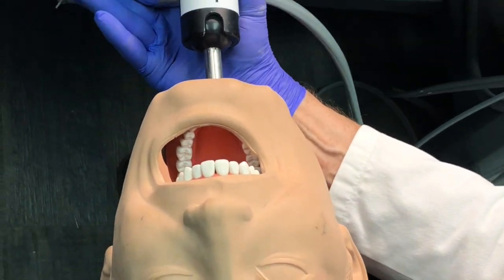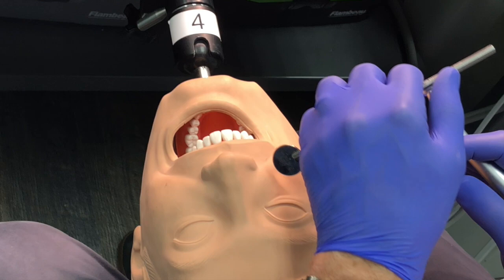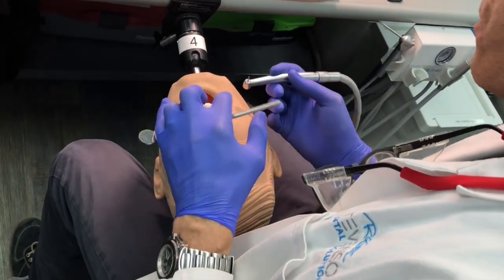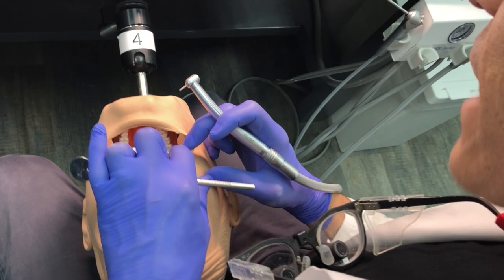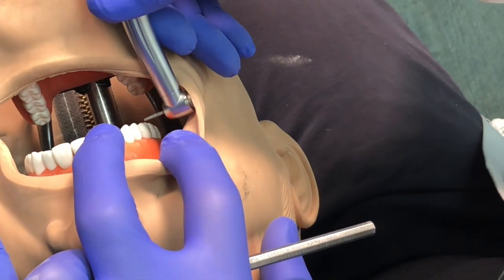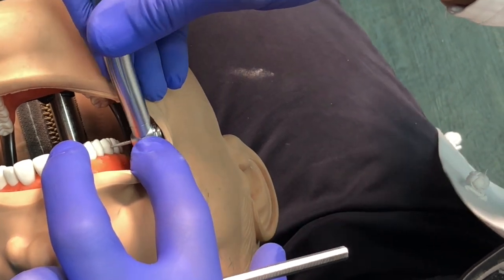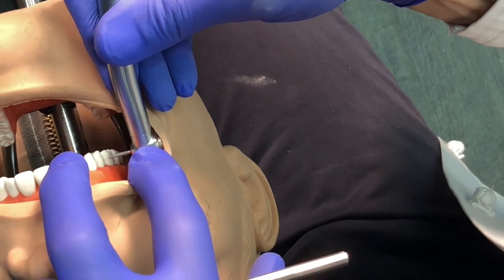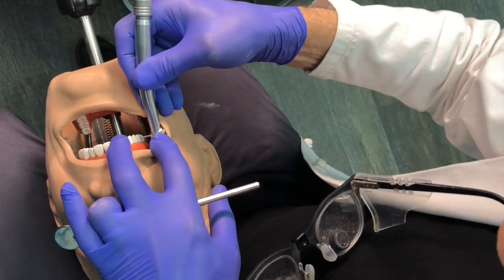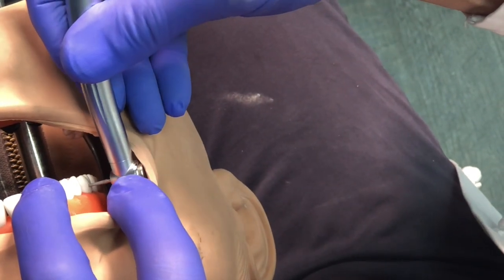If you have a Class V on a premolar or molar, you have to make a modification. I'm going to turn the patient to the left, maybe 25 to 30 degrees. It's very comfortable — patients actually like being moved because they've been frozen in one position. Now I can retract the tissue, use a finger rest on the retracting hand, get the handpiece in position, and put the retracting finger on the handpiece head. All my stabilization comes through that index finger.